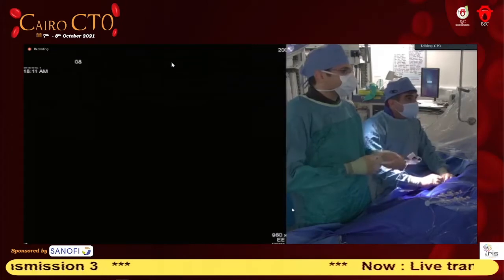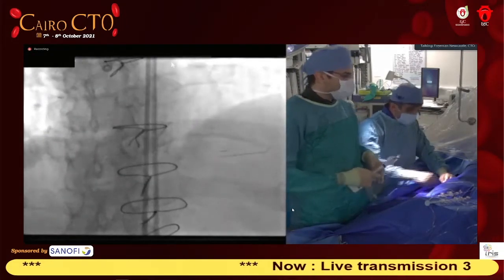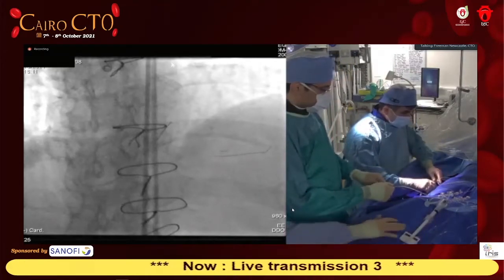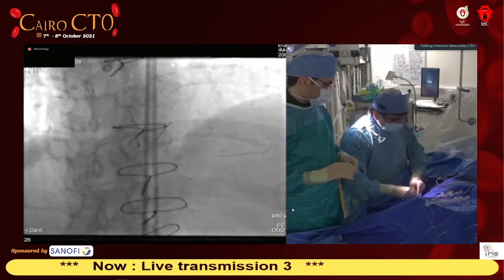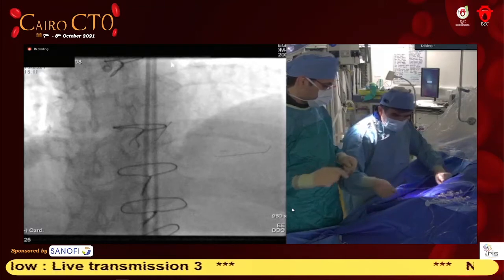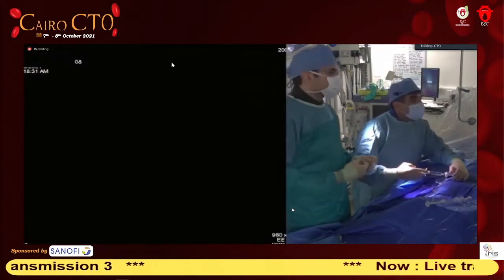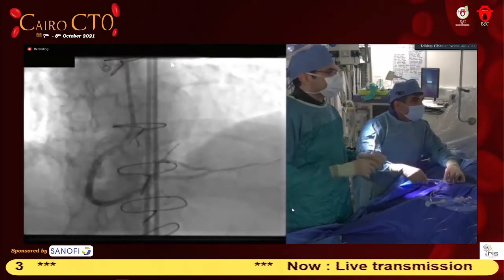It will be difficult with a long stent without a guideliner to cross this bend. Yeah, I think you're probably right. One option would be, I have a balloon here, I could use an anchor balloon. I've got 7 French, so I could anchor the balloon distally and deliver my stent on the second wire. But I think a guideliner would be much easier. The distal RCA is seen from the graft from the first injection that it's a very diseased segment.